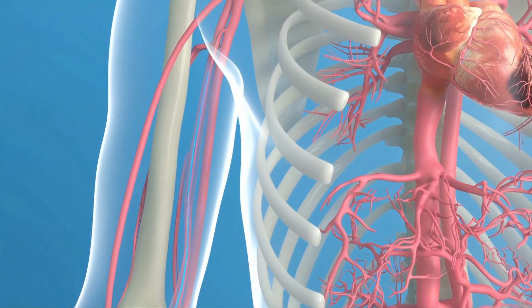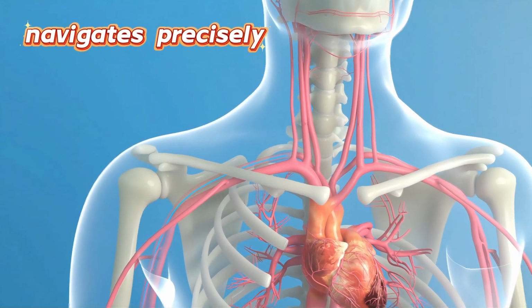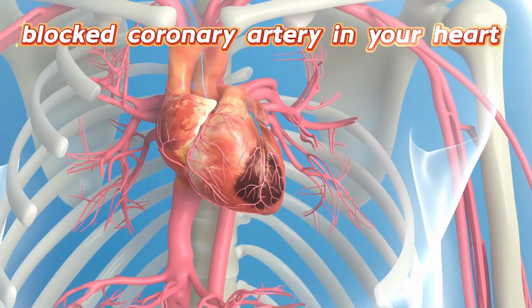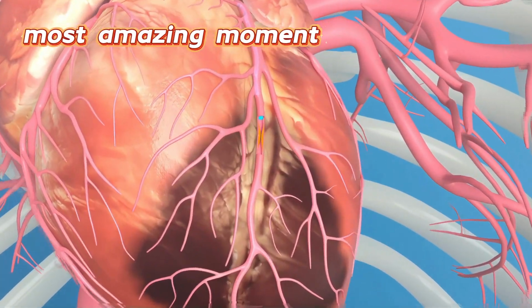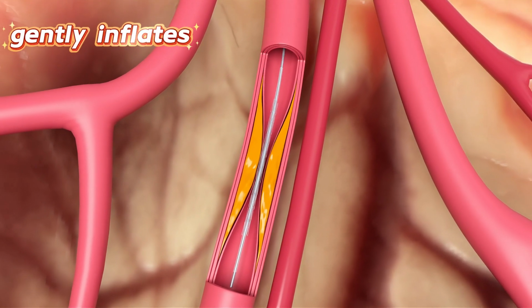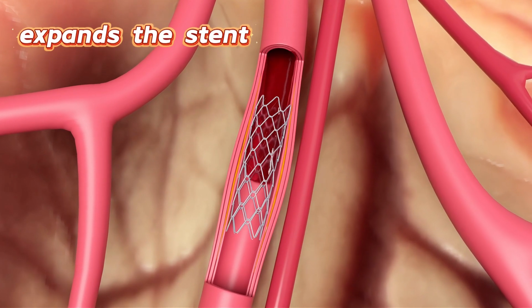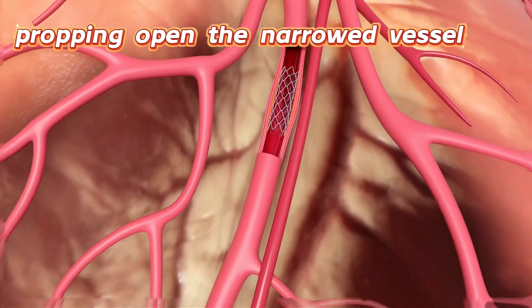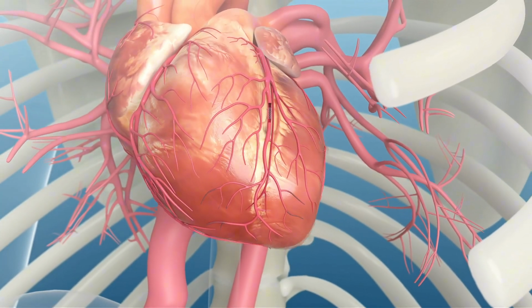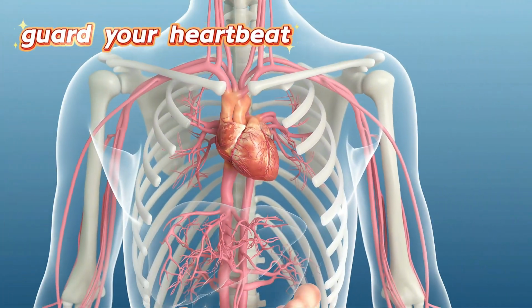It travels up through the artery in your arm, winding its way along, and finally navigates precisely to the blocked coronary artery in your heart. Then comes the most amazing moment. A tiny balloon at the tip of the catheter gently inflates, pop. Like opening an umbrella, it expands the stent, instantly propping open the narrowed vessel. Mission accomplished. The catheter withdraws, leaving only the stent behind to guard your heartbeat.